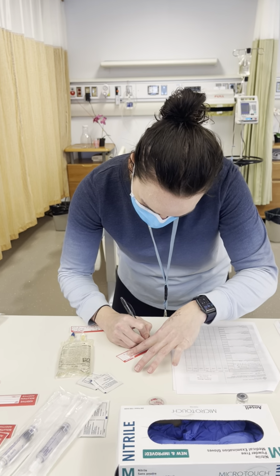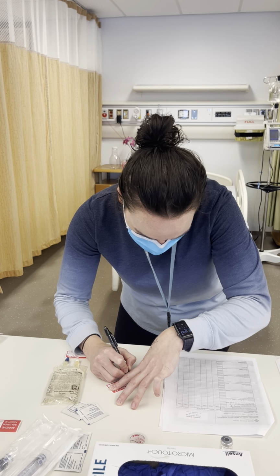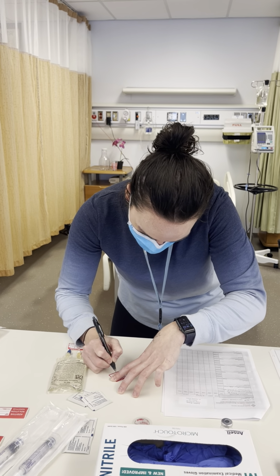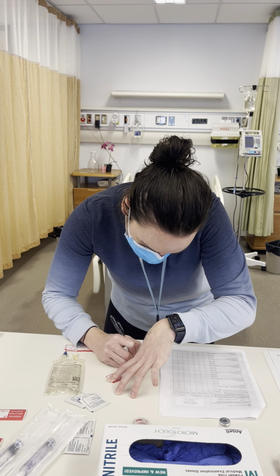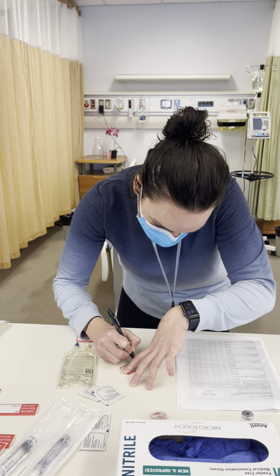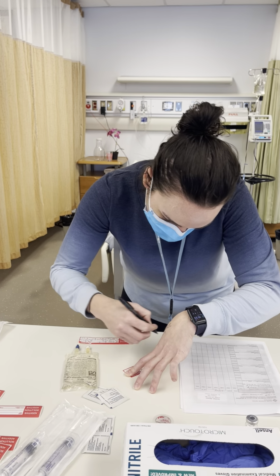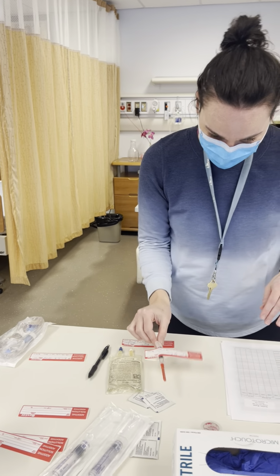So we've got Humulin R, and we can put 2 units per hour, room number, you can put our patient's name if you want. We'll put our March 28th, 1830, our initials, and that's good. So we'll have that ready for that.